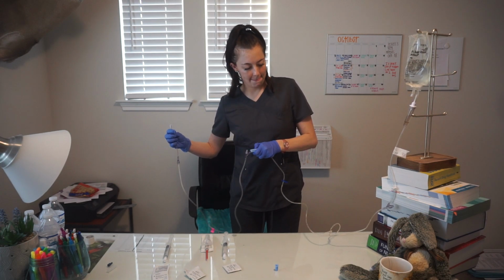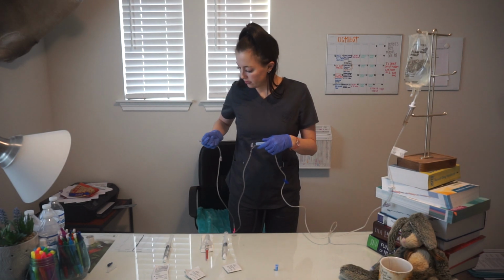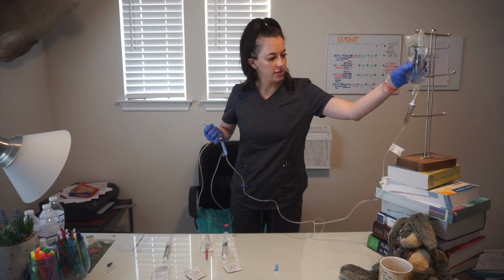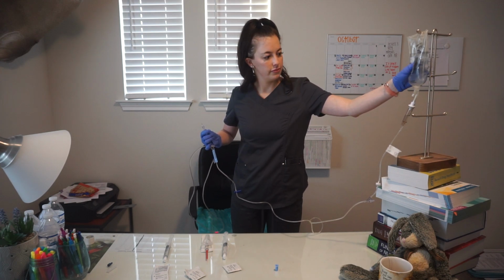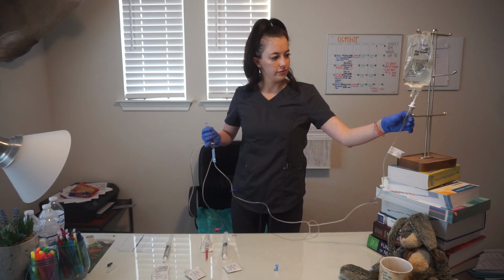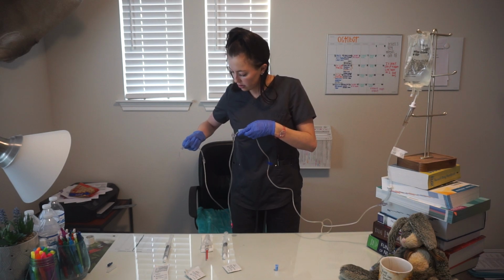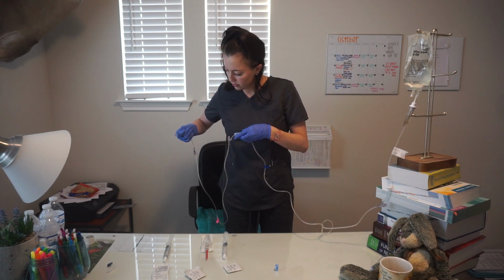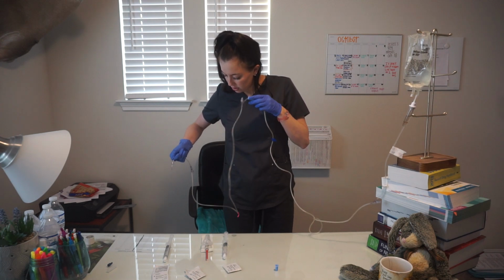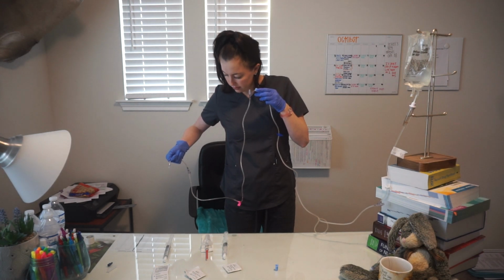Okay. Might have to squeeze the bag a little bit. There we go. Get rid of all those air bubbles.